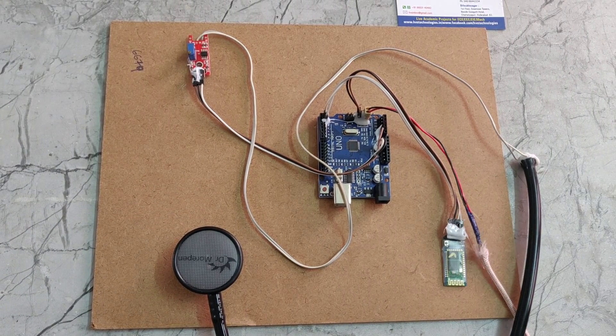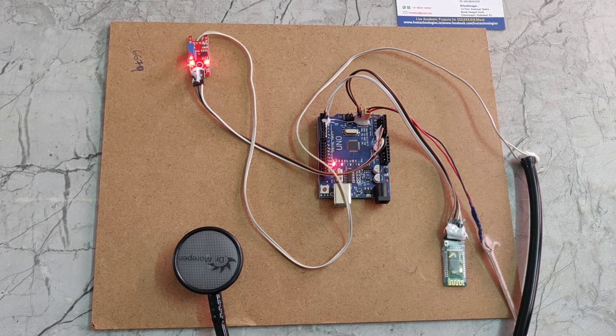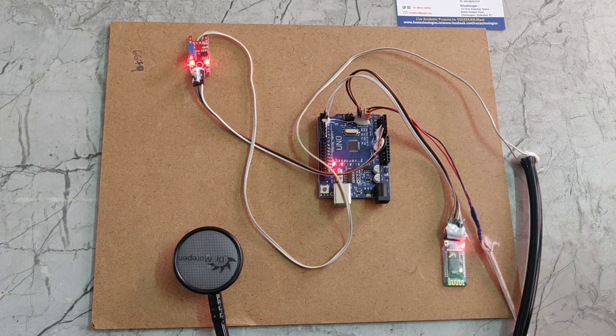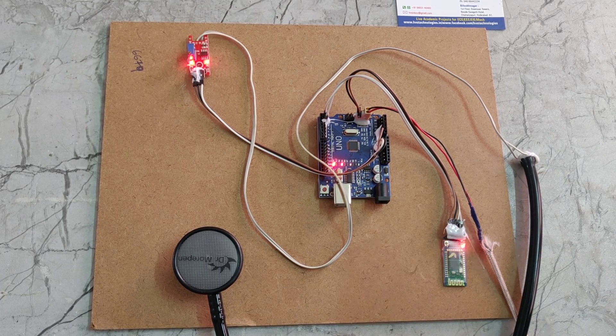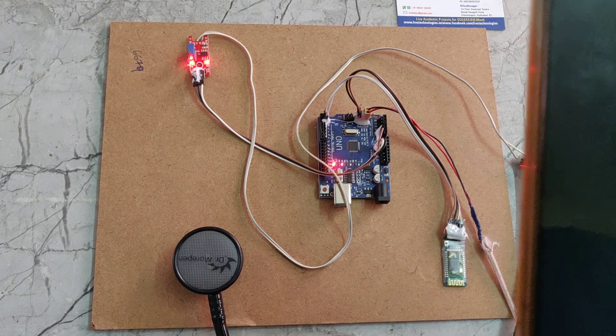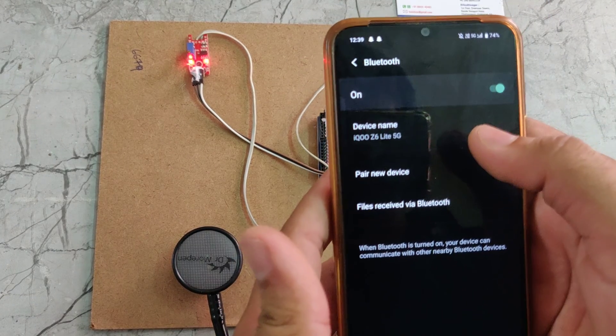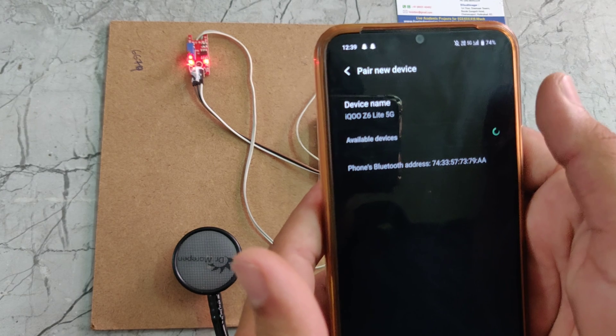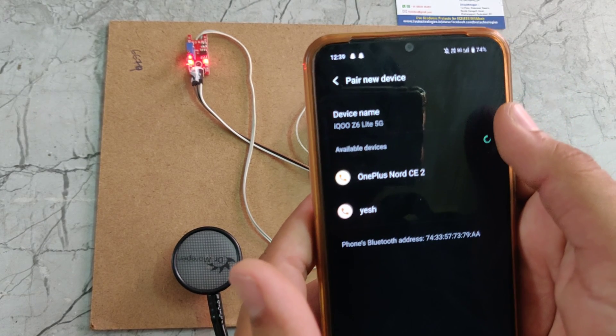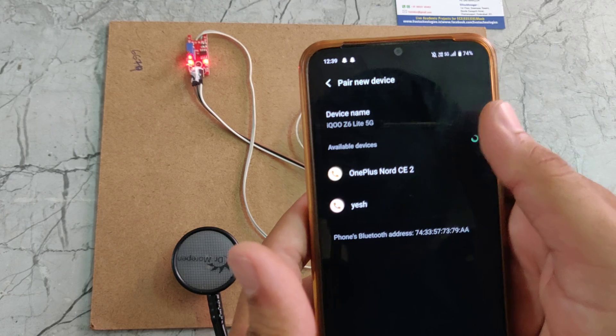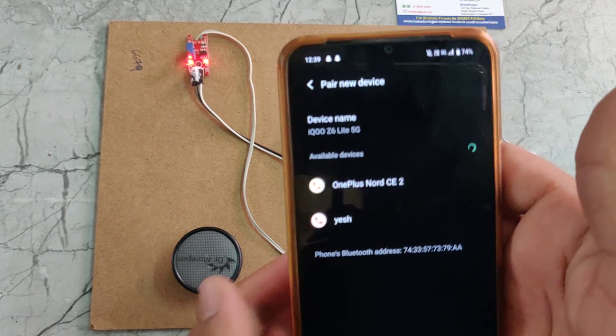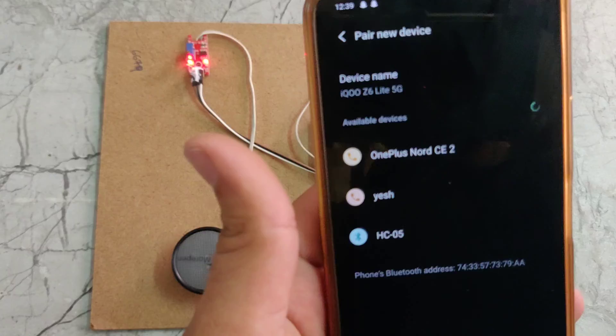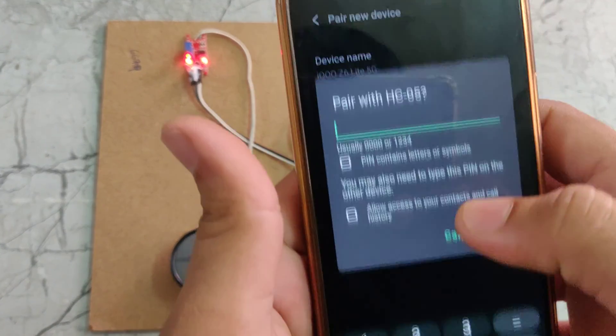Now I am giving the power supply. After the power supply, we need to go for the Bluetooth settings. Here we can see in the Bluetooth settings, this is 05. We need to go for this one.